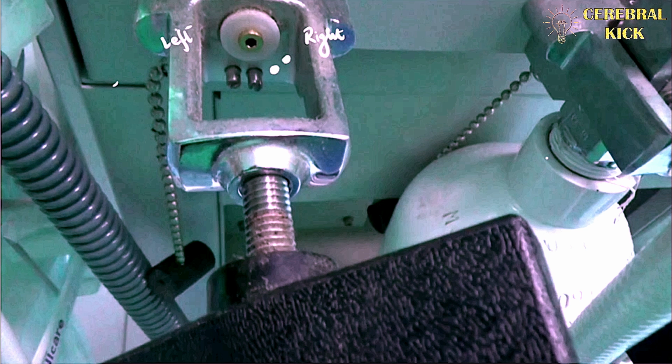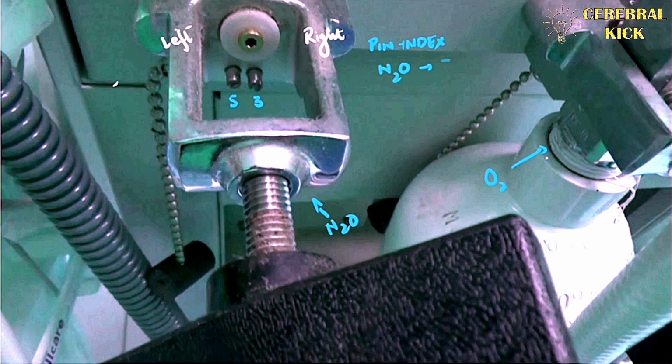If we see it practically on a hanger yoke assembly, the pins are indexed as 1 to 6. The trick is that every gas has a specific pin order. For nitrous oxide, it is 3-5. So it will only fit into the compatible nitrous oxide cylinder valve, having two holes that are aligned and oriented in 3-5 position. Let's say if we have an oxygen cylinder with a 2-5 position, that oxygen cylinder valve will not fit into the nitrous oxide inlet.